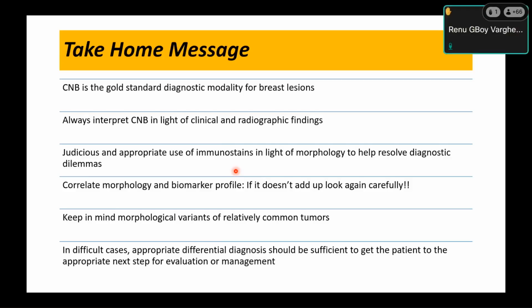For benign phyllodes, we don't know, because this lady was 42. It's a small biopsy. If at all it shows some phyllodes-like areas later on, we don't want to go for further. See, margins are essential for phyllodes tumor. It's not the enucleation. So if you cannot comment, please say cannot comment on that. Benign fibroepithelial neoplasm is good enough.